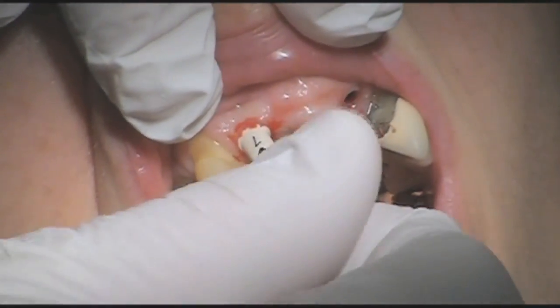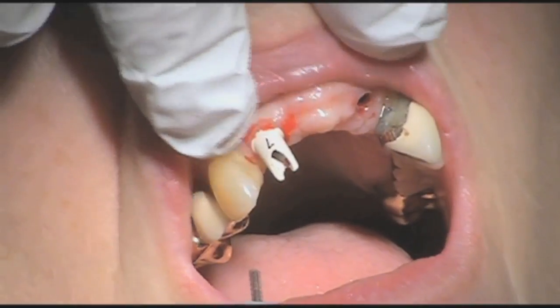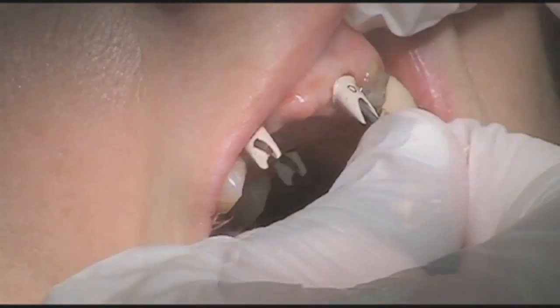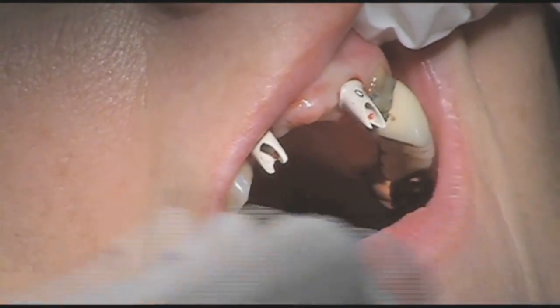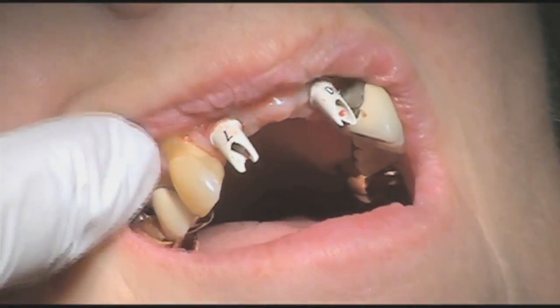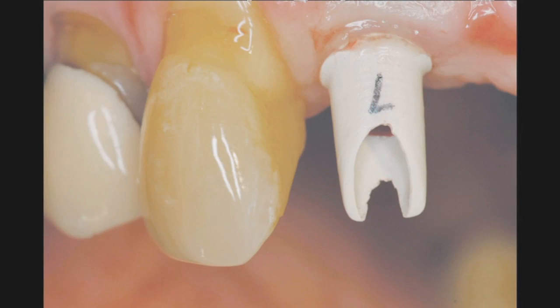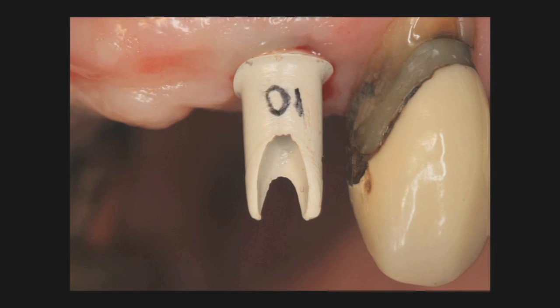Because the implants were indeed torqued to 35 Newton centimeters, I decided to go ahead and place our temporary abutments, positioning them into place to accept the provisional bridge from maxillary right to maxillary left lateral incisor. Tissue contours are being established for the first time right following surgical placement of the implant. This is an amazing step towards prosthetic reconstruction.